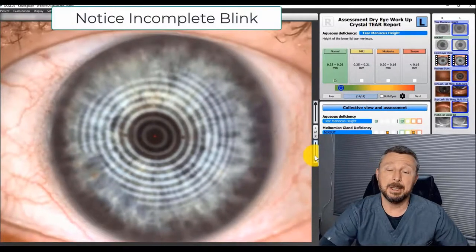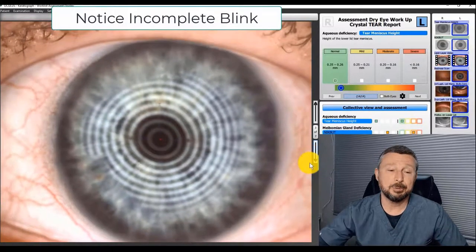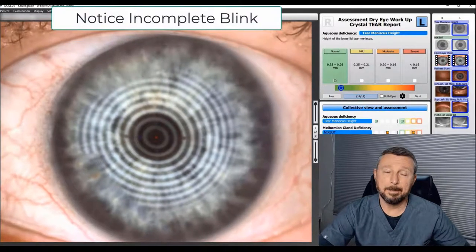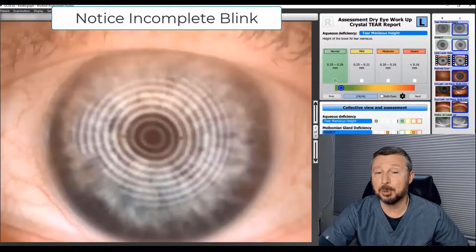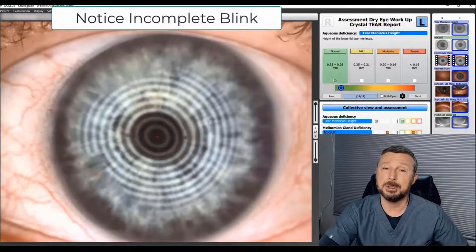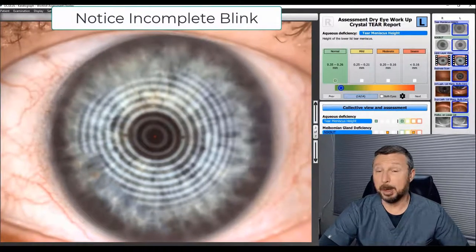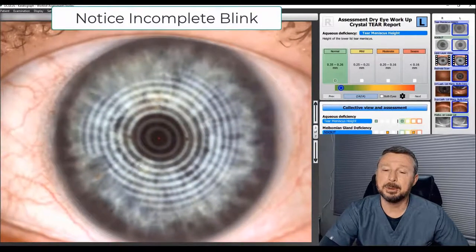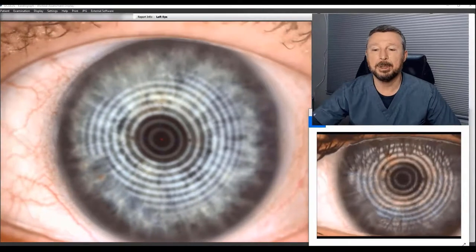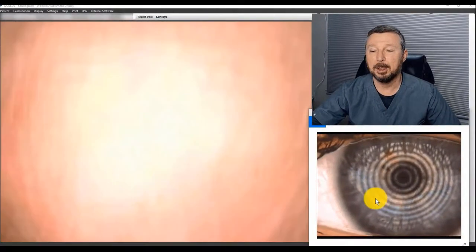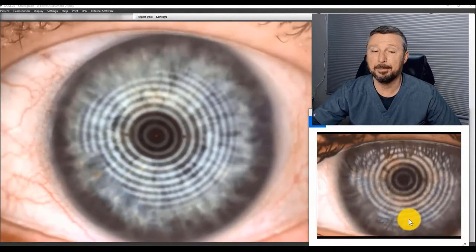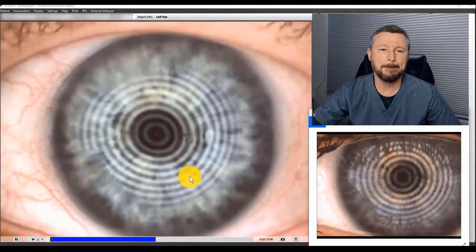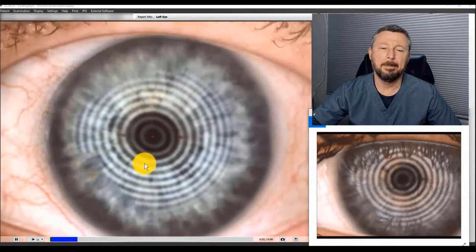Next, we look at the lipid layer, or oil layer, of your tear film. This layer is produced by glands along the lid margin. With each blink, the pressure should squeeze out tiny droplets of this oil, which should be about the consistency of olive oil and clear in color. It floats on top of the water layer. When it does this, it has a characteristic iridescent appearance — reds and blues. This reference shows a nice healthy oil layer. When we look at your eye, we can see there is no oil there. There may be a little bit of thickened secretion, but that's not going to keep that eye wet.